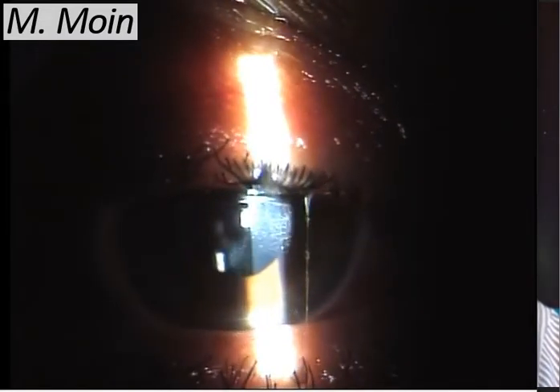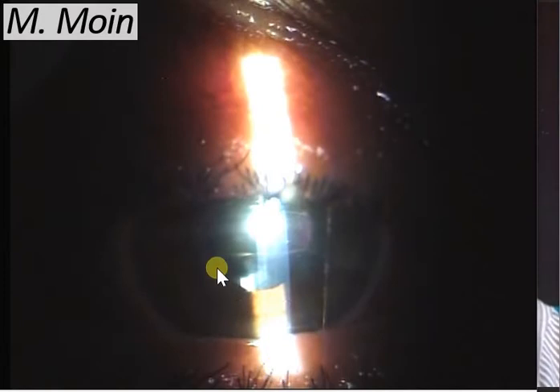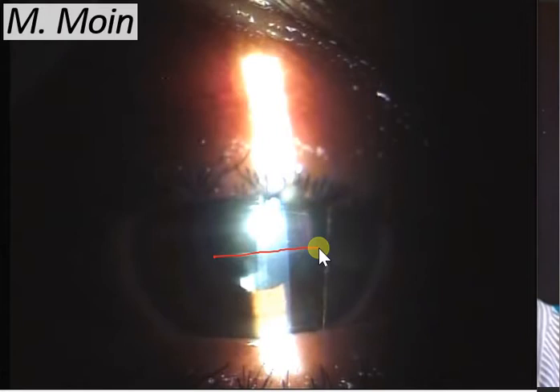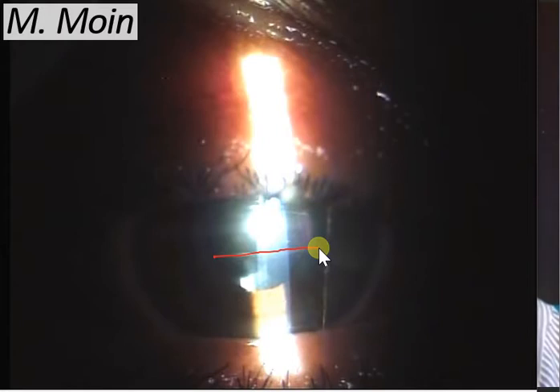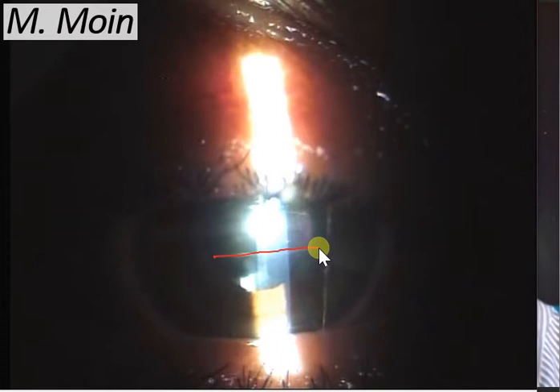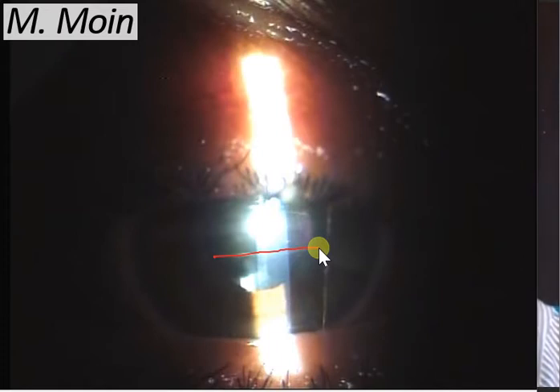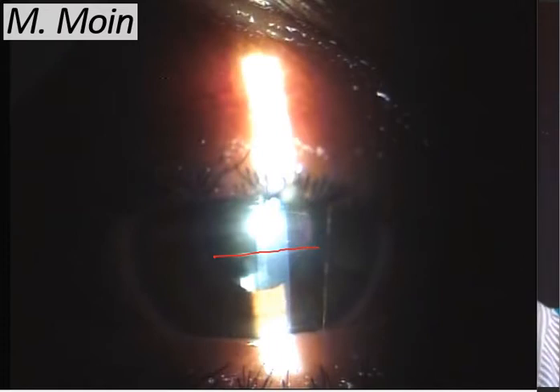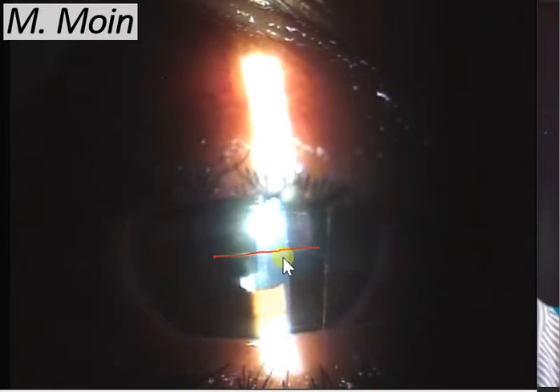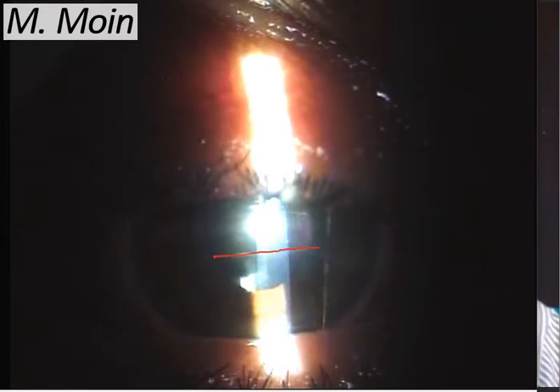This is the area of the gas bubble which you need to identify very early, because gas can be confused with oil. But gas has a buoyancy of its own and it tends to move much more quickly than oil. This patient had about sixty to seventy percent fill of gas.